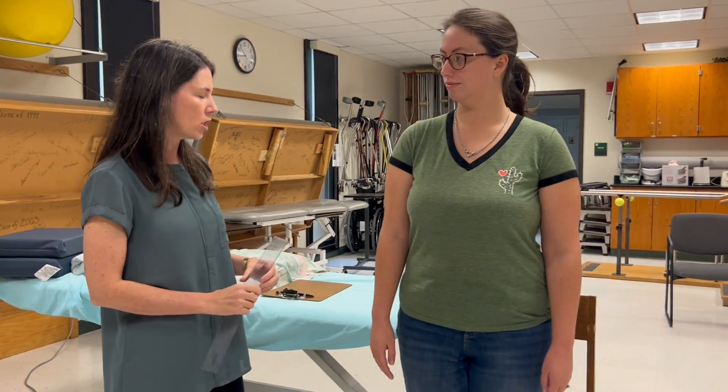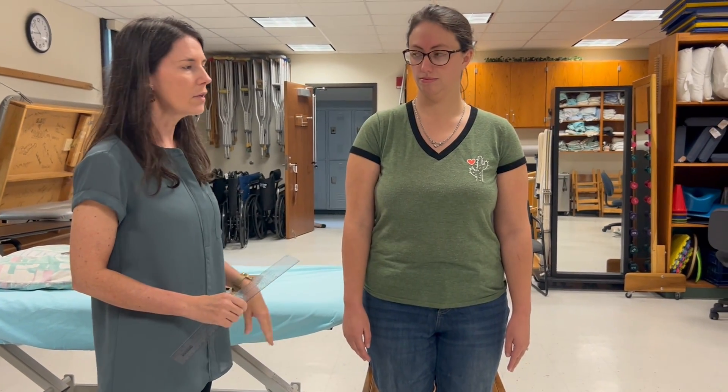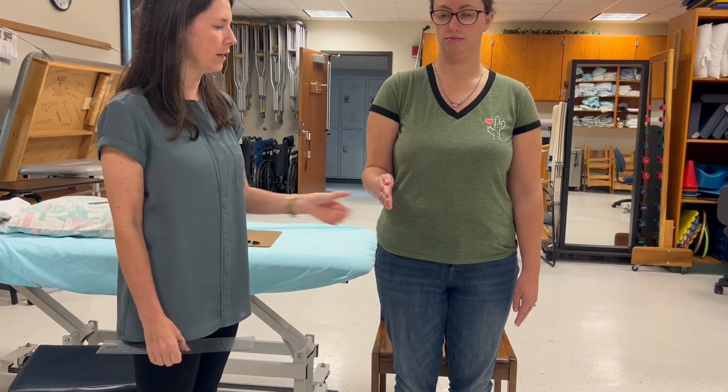Patient position can be either standing or sitting. Obviously you're going to choose sitting for someone who cannot stand, who has a balance deficit or similar issues. I like to do it standing if possible, so I'm going to demonstrate it with the person standing — elbow flexed 90 degrees, forearm in neutral.